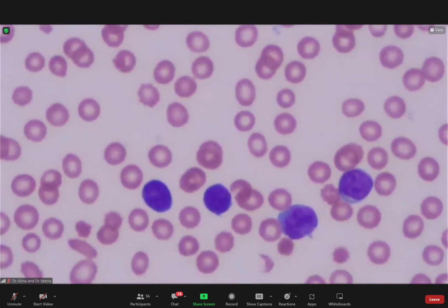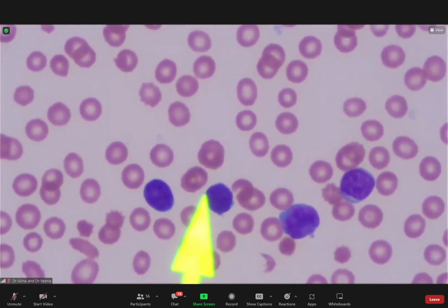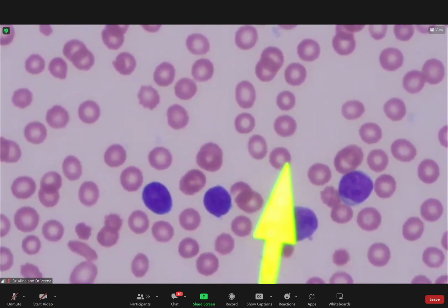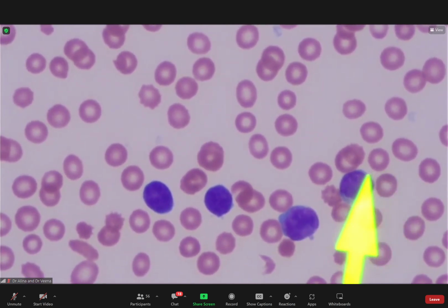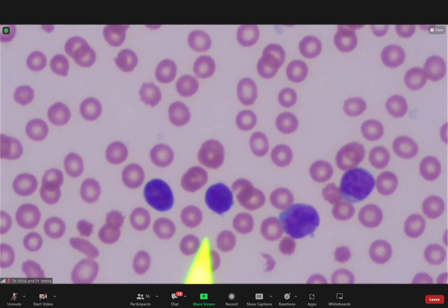In terms of color, they differ. Right? You have a question? Okay, I repeat. The one on the left is lymphocyte. This is blast. This is lymphocyte. Okay. So just appreciate the nucleus. If you see the nucleus, the clumped chromatin is mature. The lacy chromatin or the lacy nucleus where you can actually see the netting in between, that's a blast. You can see the netting, or you can actually so-called see through.